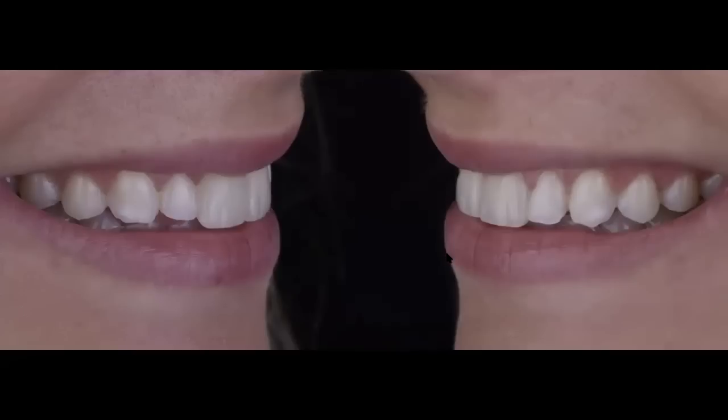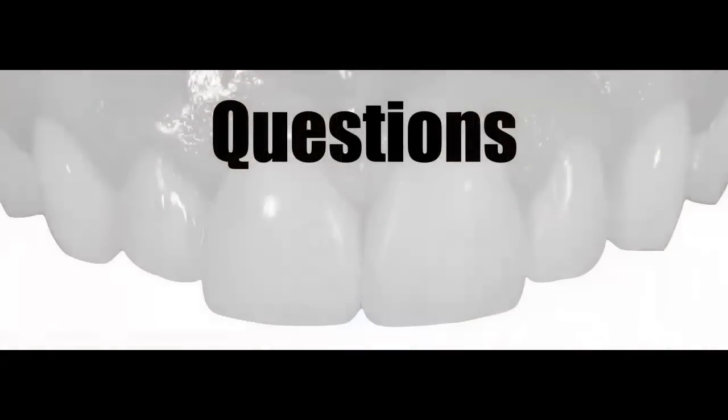You can see the tertiary anatomy and the way that the light is broken when it reflects on both 8 and 9. And in a full smile, you can see the smile improvement and the added length, the added dominance that the patient wanted and that we wanted to help her achieve on both 8 and 9 by lengthening the central incisors. So this is our final slide.